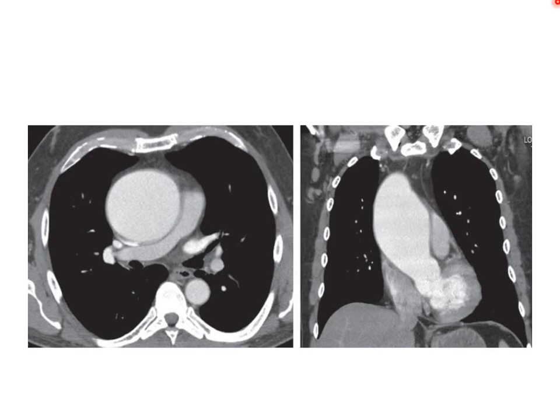For example, sparing of the posterior wall of the aorta goes with what? Inflammatory aneurysm. Okay. For example, gas in the wall goes more with infectious causes. If you see the ureter pulled medially and the aorta taped to the spine, you can think of retroperitoneal fibrosis.